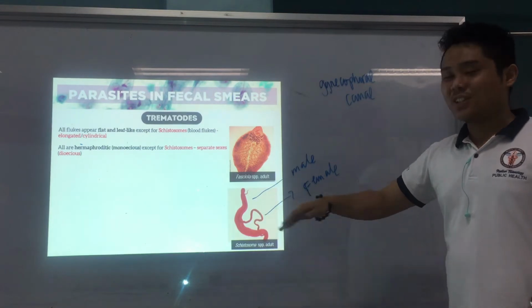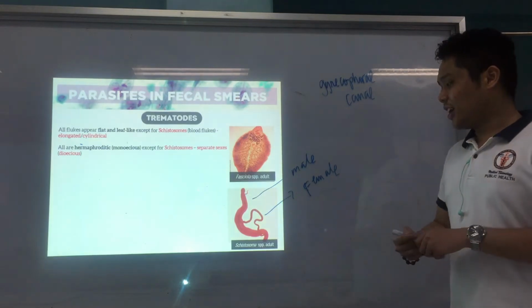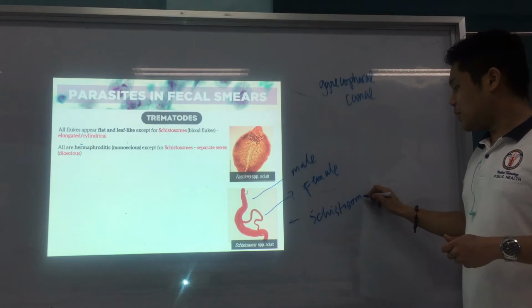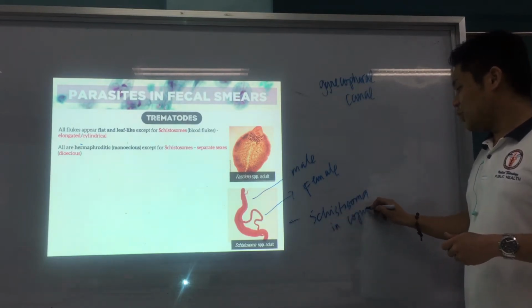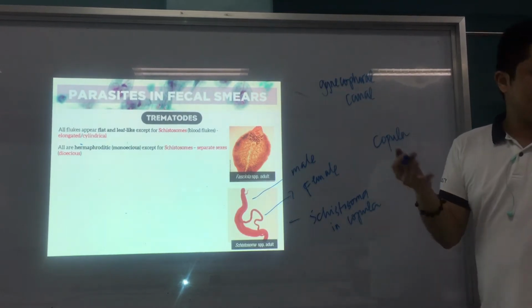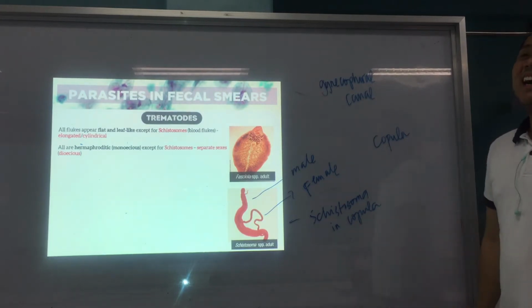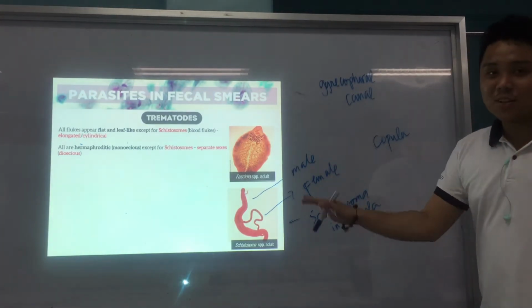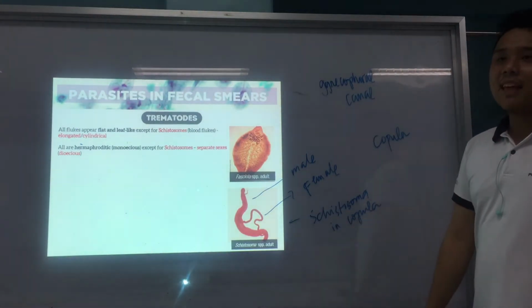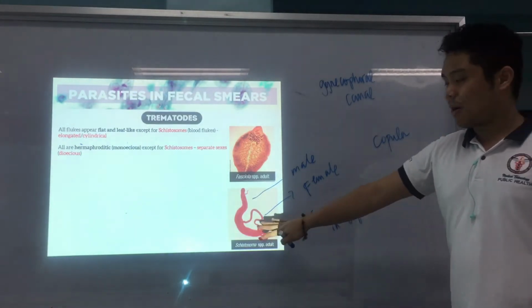Now, once your Schistosoma adults reach this position, this is known as Schistosoma in copula. Copula, meaning they are copulating. They are reproducing. They are always constantly in sex. Sana all, charot lang. Forever na gid silang inani. They will appear like that until they die, and they always produce eggs na. So that's how they reproduce.